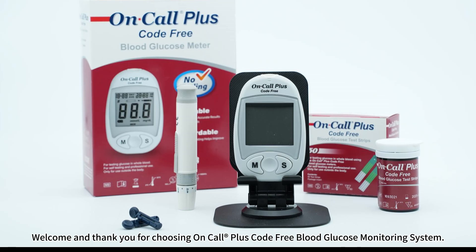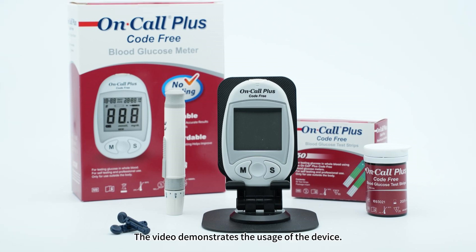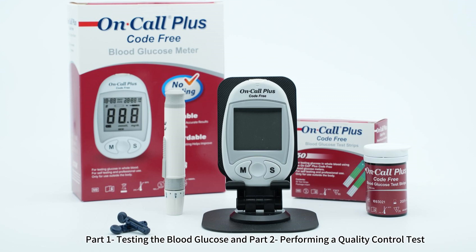Welcome and thank you for choosing On Call Plus Code free blood glucose monitoring system. This video demonstrates the usage of the device. The video is divided into two parts: Part 1, testing the blood glucose, and Part 2, performing a quality control test.